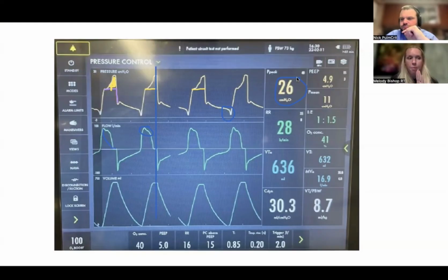For me, I probably would try to then go back to pressure control and match them and leave them in a control mode, because I think there's a risk of leaving them in pressure support with someone following that then deciding to give more sedation or something. I tend to like to leave them back in a control mode. No, I do too. I agree 100%. I usually put them back into controlled mode.